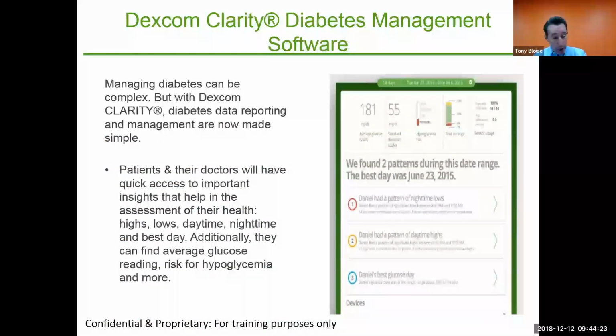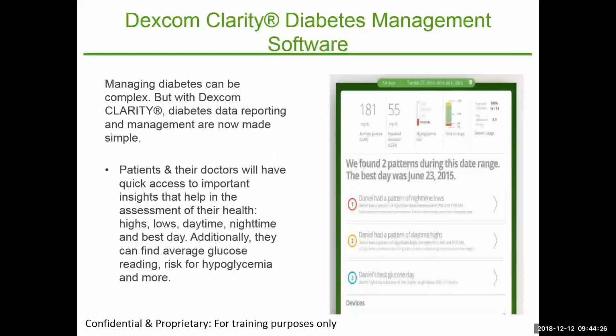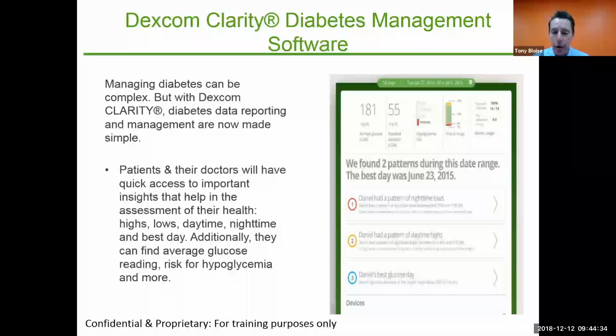Another feature that's popular, probably more with physicians than it is with patients, is the Clarity app. This is another app that patients can download onto their phone. And as you can imagine, if you're getting a new glucose reading every 5 minutes, 24 hours a day, 7 days a week, that generates a lot of data. And doctors love data. So you can share your data with your clinician through the Clarity app so that they can see what your trends have been over the last 30 days. And then they can help manage your diabetes in terms of making adjustments to your medicine and your diet and things based on the data. So it's a treasure trove of data. Clinicians love it, and that's a popular feature as well.